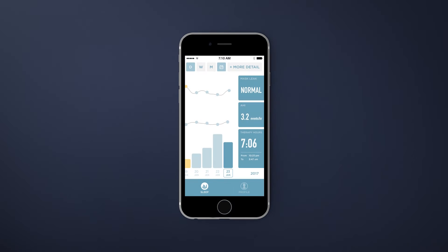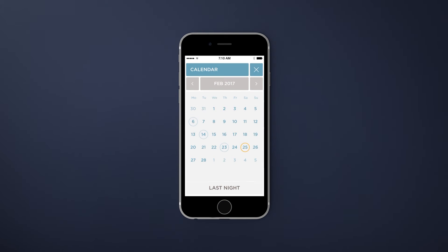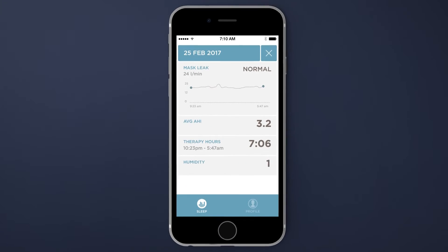You can see patterns in your data and recognize changes in your therapy. You can dive deeper to gain a greater understanding of your therapy throughout the night.